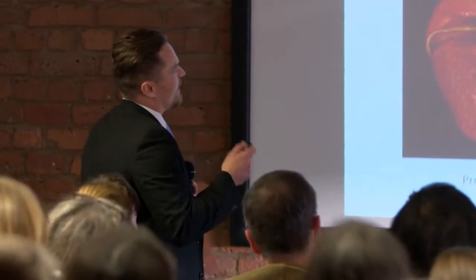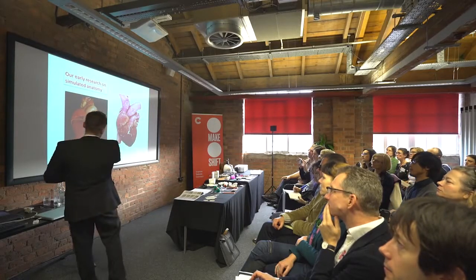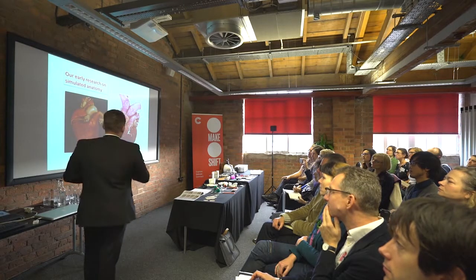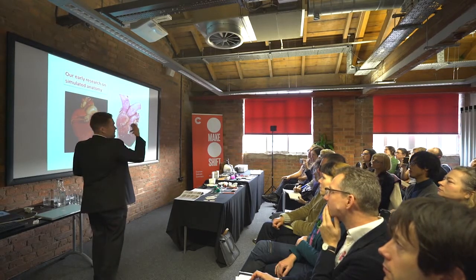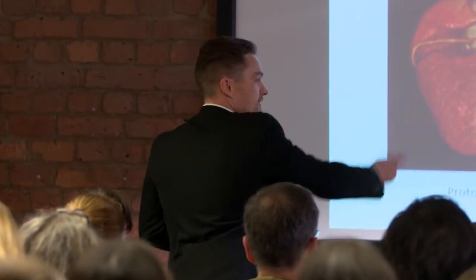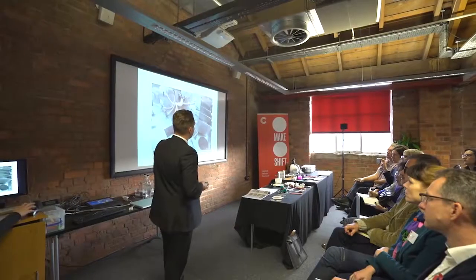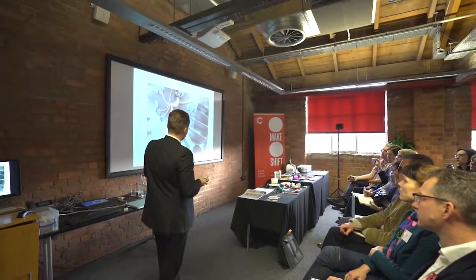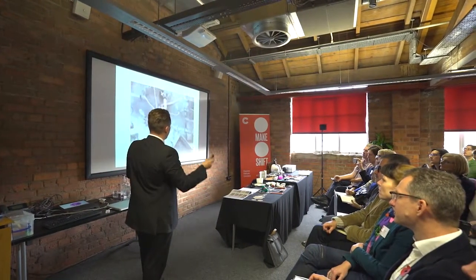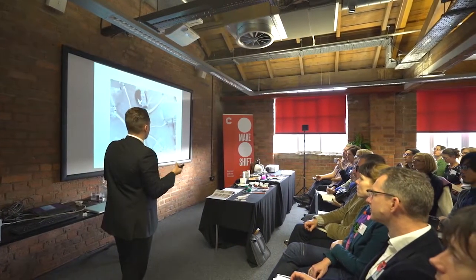So this is an early prototype that we did of a 6-year-old's heart. You can see on the left, this was the stripped back digital model. On the right, this is the fleshed out simulation, if you like. So digital model, silicone simulation. This is a collaboration we did with King's College London, the biomedical department. And we're looking to simulate a coarctation, which is narrowing of the descending aorta in a patient-specific study.